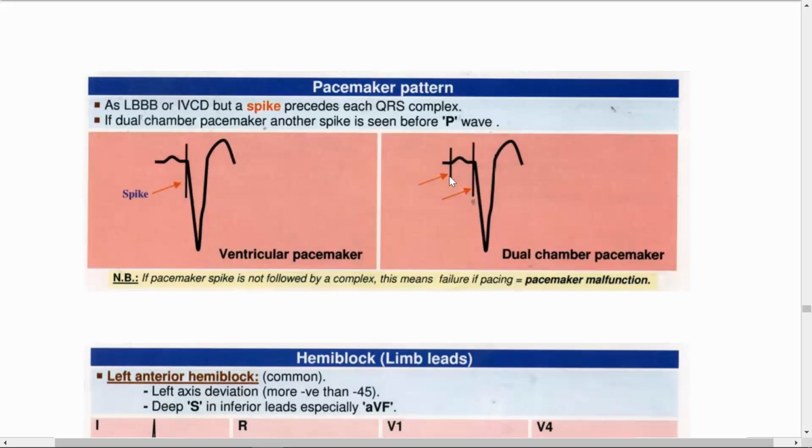So we need AAI. What will make the AAI? It will make atrial pacing. The pacemaker will sense first. If there is activity, it will inhibit itself and will not interfere, and if there is no activity, there will be atrial pacing, and we'll go directly through the AV node, the conductive pathway, and there will be a narrow QRS complex and nothing else.